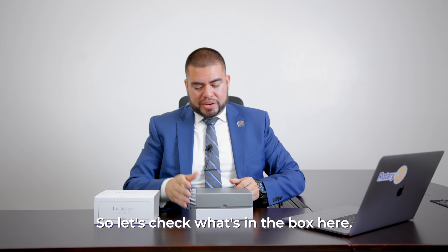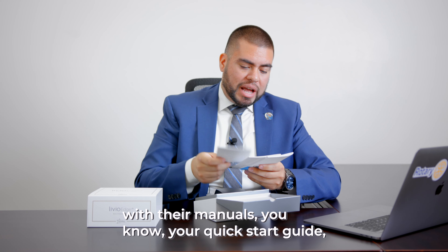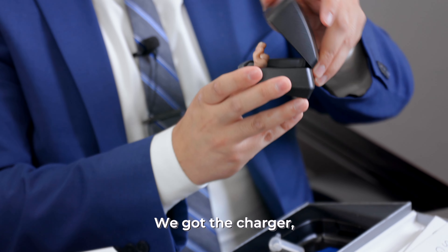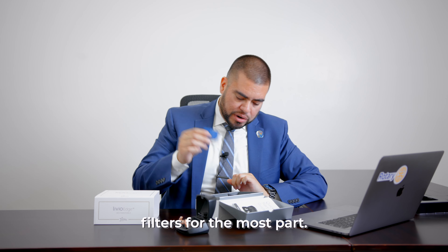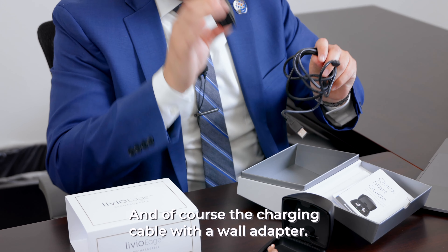Let's check what's in the box here. Every hearing instrument always comes with their manuals, your quick start guide, the user guide. We got the charger, the actual custom hearing aids themselves, a few filter changes because all hearing aids have filters for the most part, and of course the charging cable with a wall adapter.